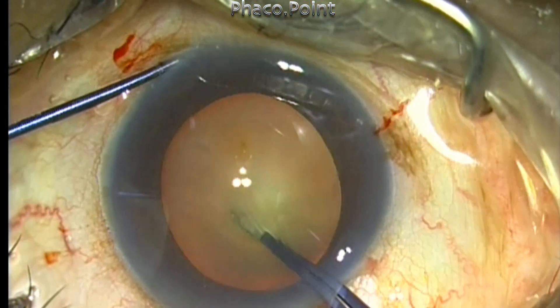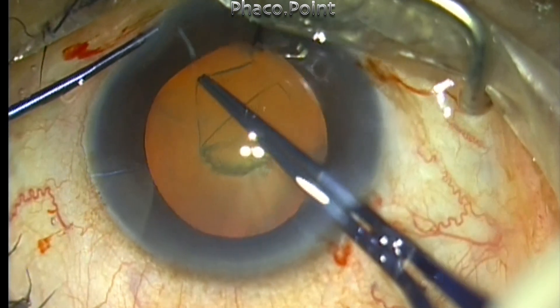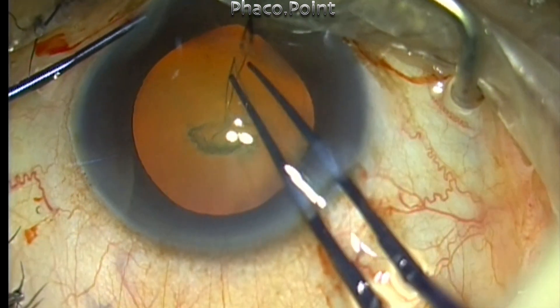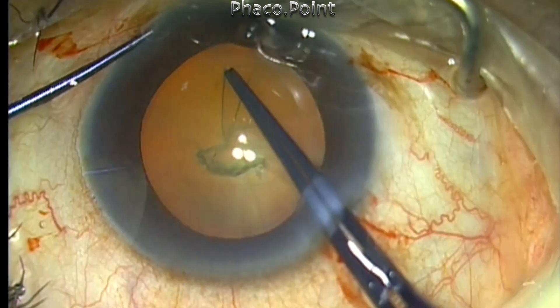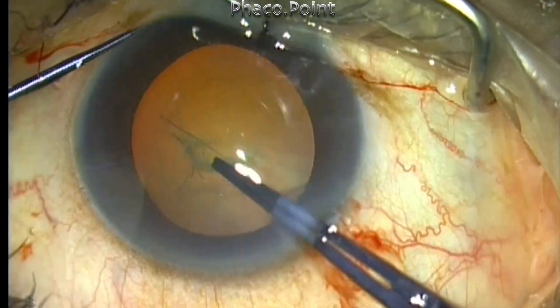The closed jaw of the forceps also largely prevents visco leak out and provides better maintenance of the anterior chamber. They can gradually graduate to the next level by using a combination of the cystitome and forceps-like flap tear, as depicted in these videos.